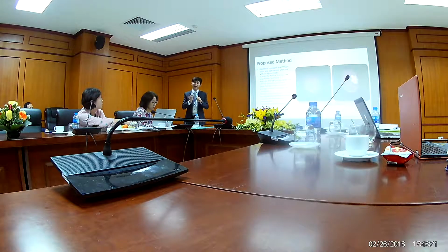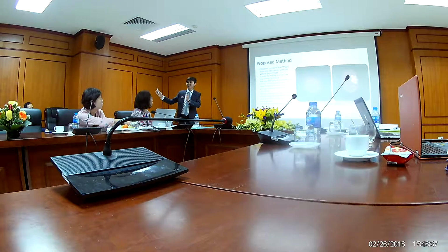We can do this skull removal in two ways. One is the threshold method, and another one is the erosion method. For the threshold method, we can set a range. For example, if a value is over 250, which is white, just remove it. But it cannot be removed totally because, as you can see, there will be some little noise around it if you use the threshold. That's why we decided to use the erosion method, which can remove it like this. And this is the picture that has no hemorrhage, and this is the picture that has hemorrhage.